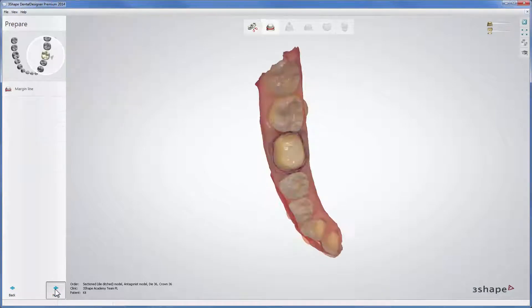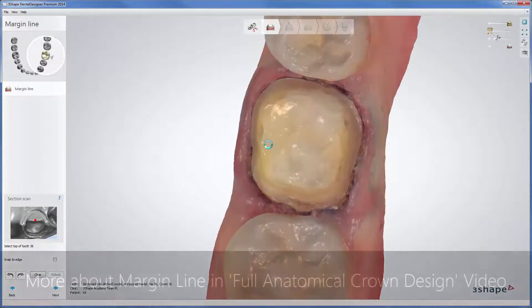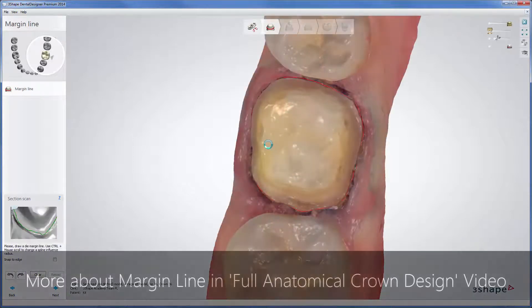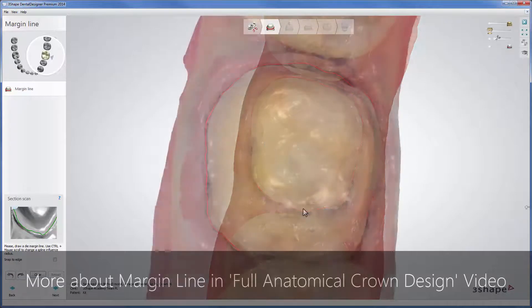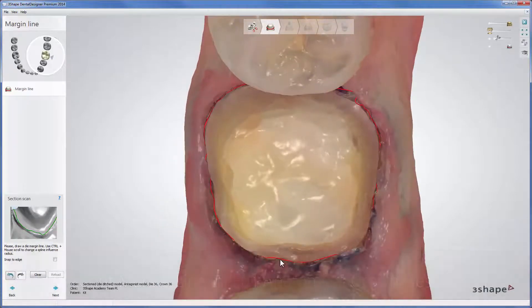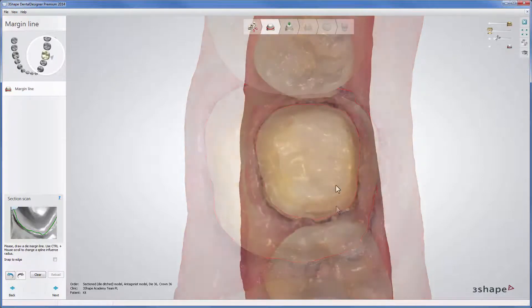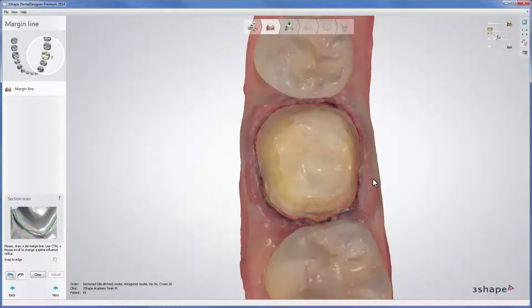Start setting the margin line by clicking the top of the tooth to automatically draw a cut-out line that can be adjusted later from outside or inside of the scan.